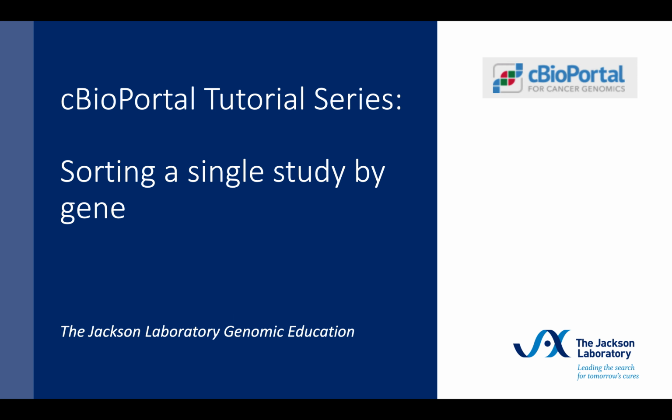This video will demonstrate how to sort study data and specifically how to filter by gene variant on the cBioPortal database.